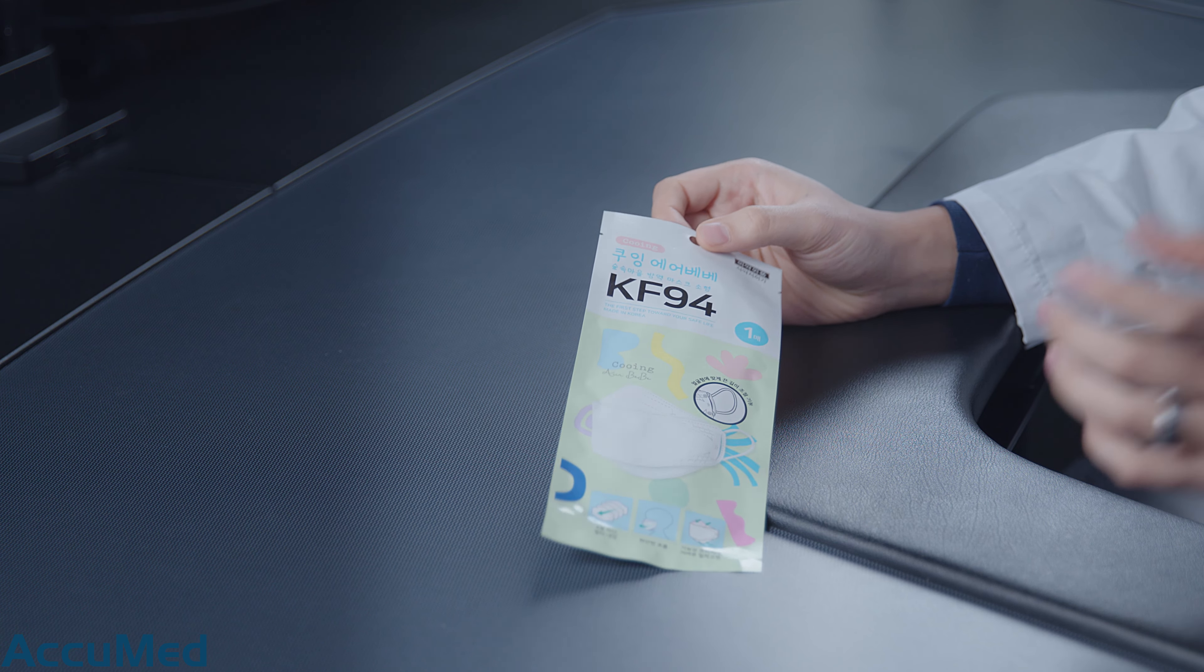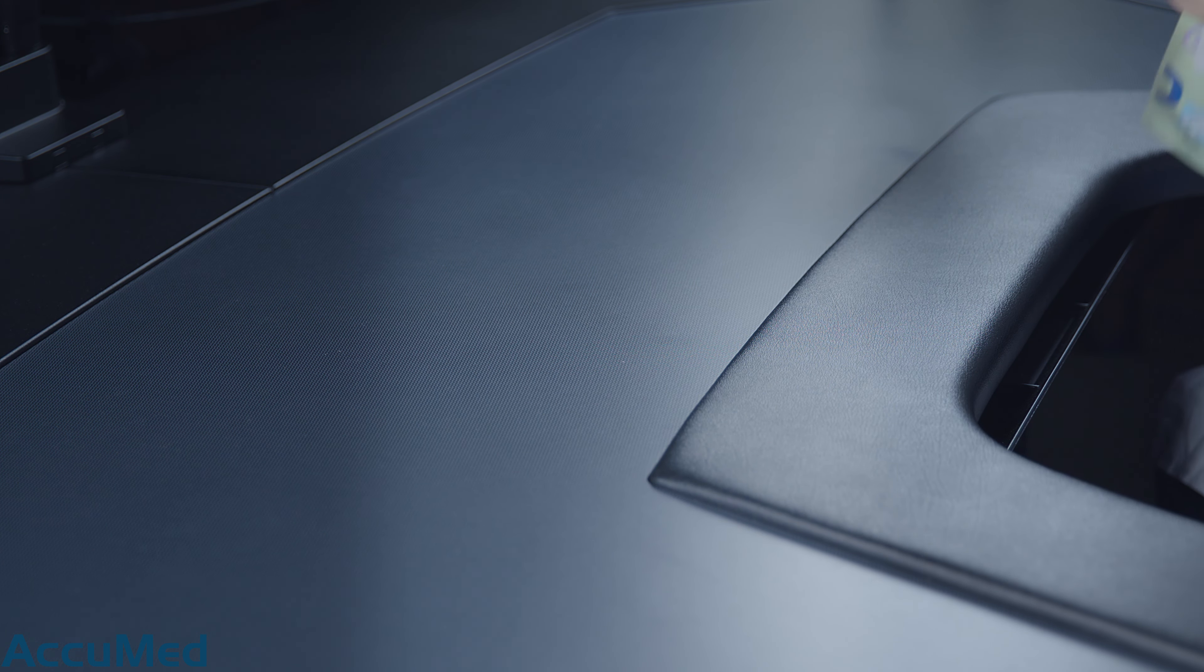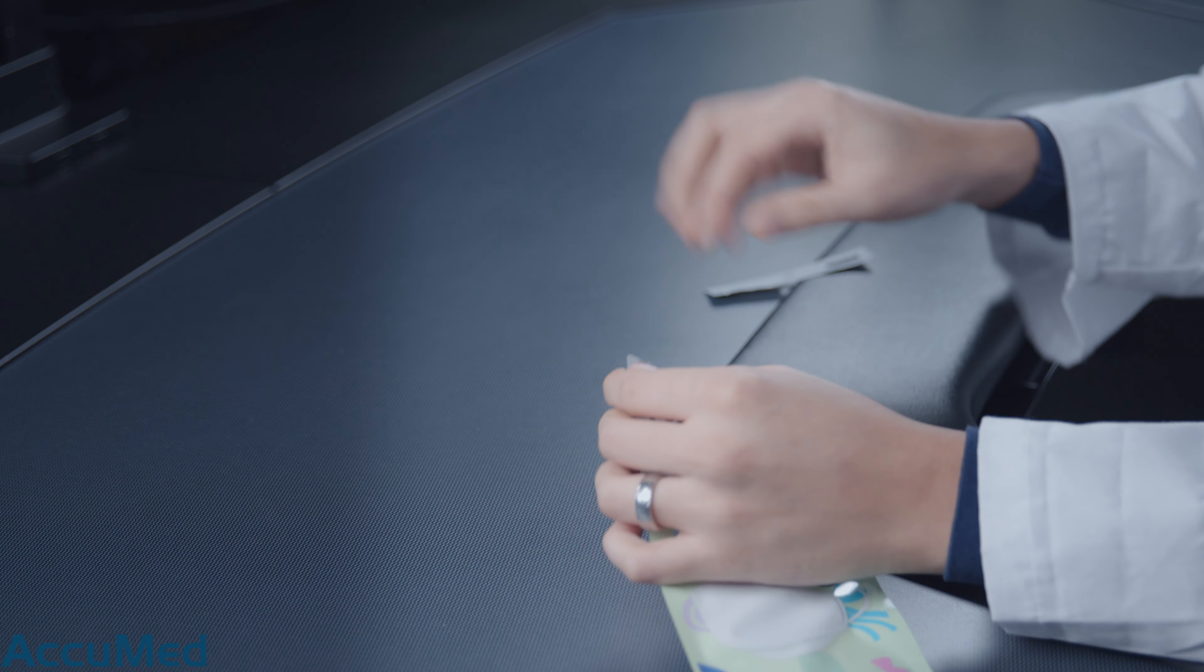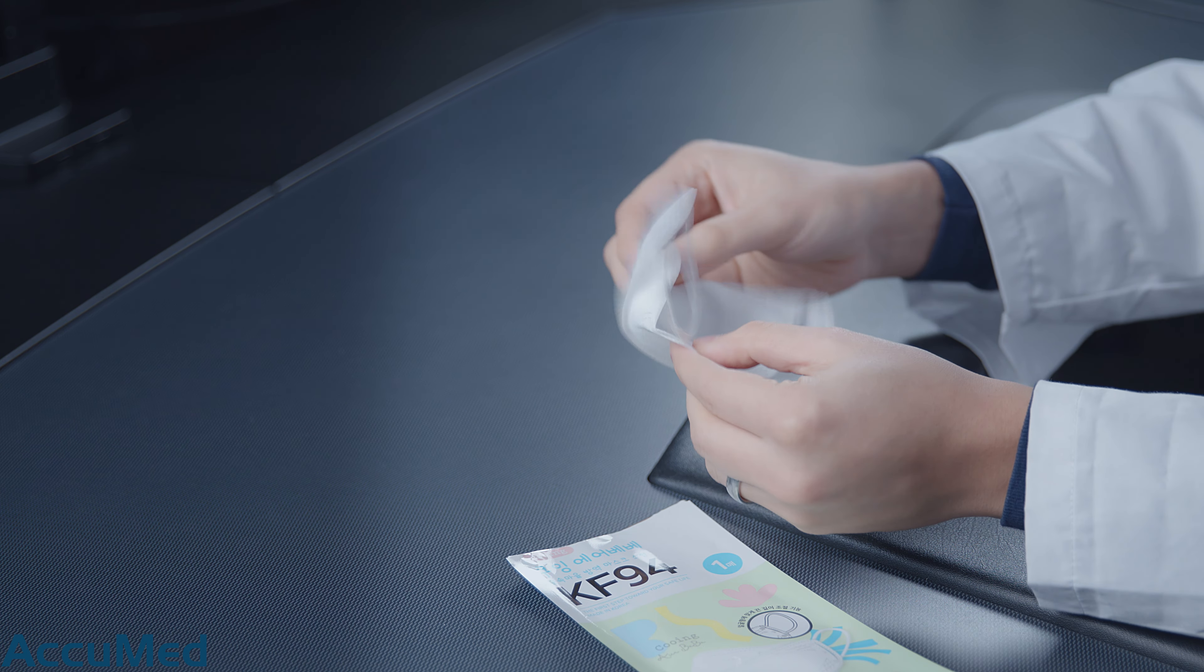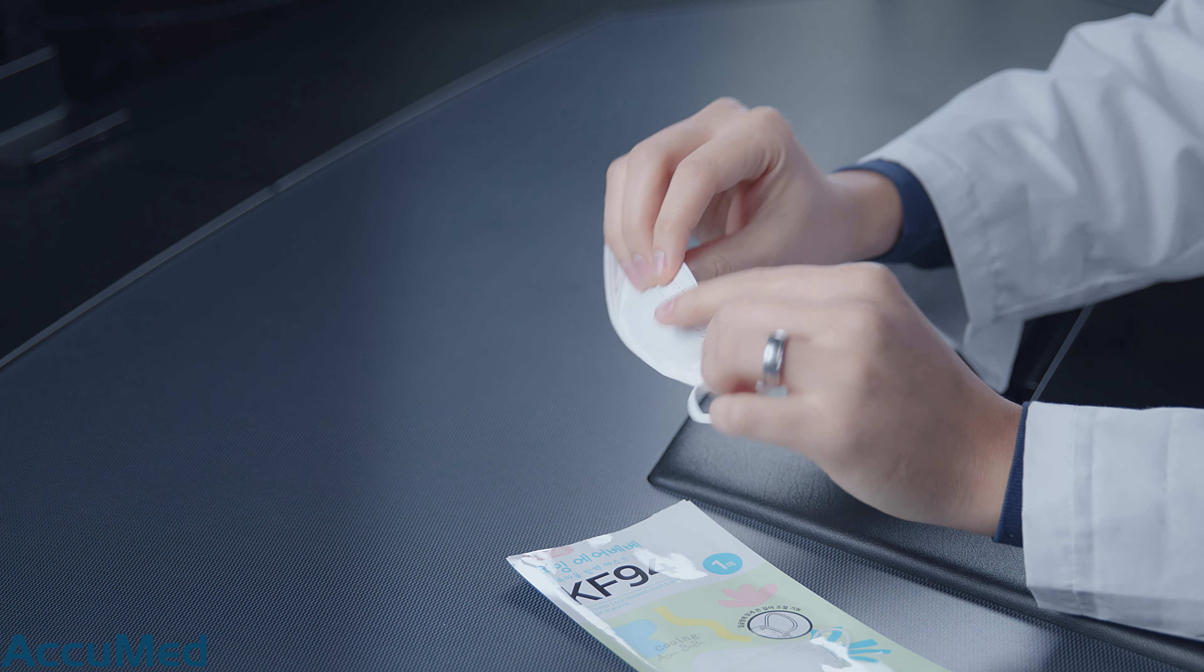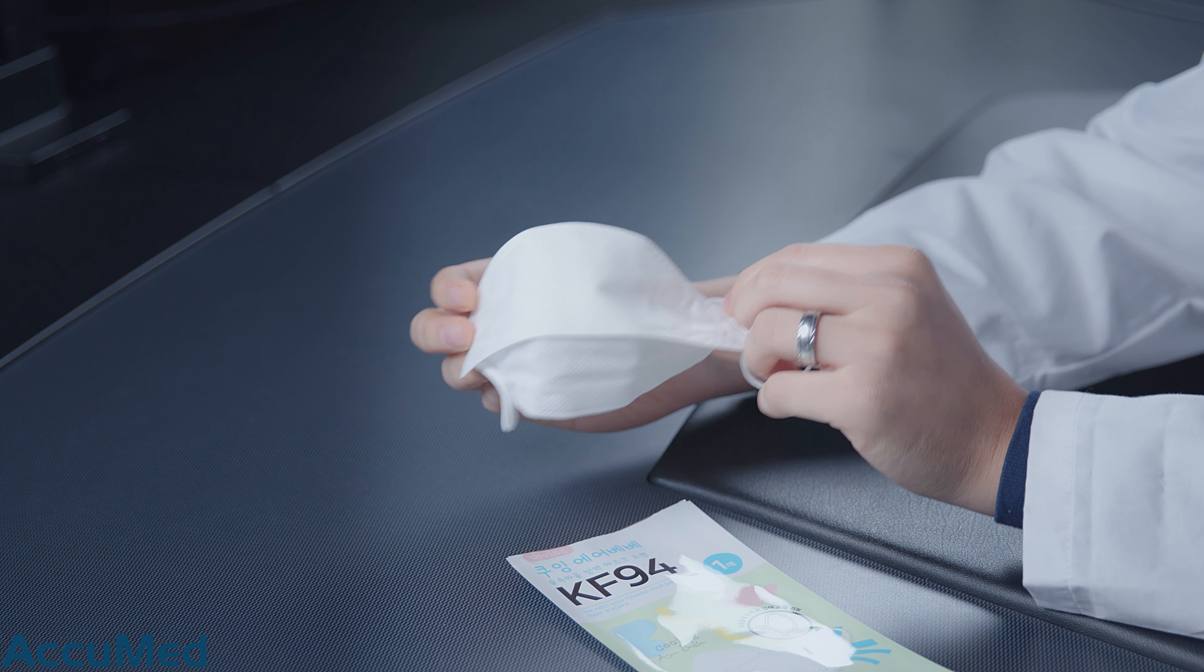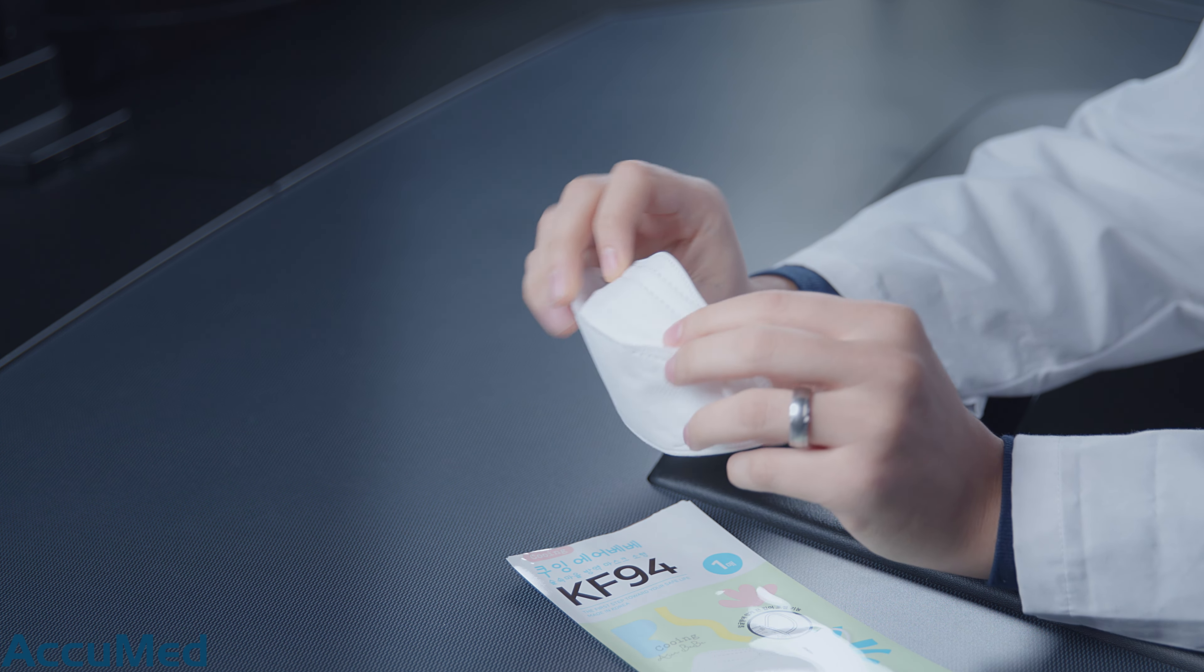Nonetheless, I do like the packaging and I do like the tri-fold style mask. So I'm going to go ahead and take it out. Now it did state on the website that these are a kid's mask, so obviously it's going to be a slightly tighter fit on me.